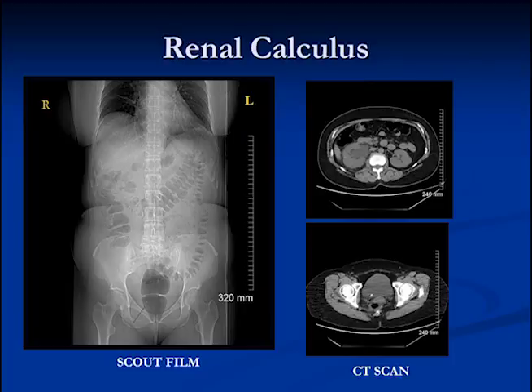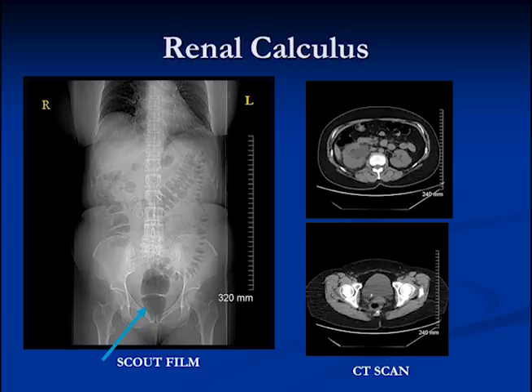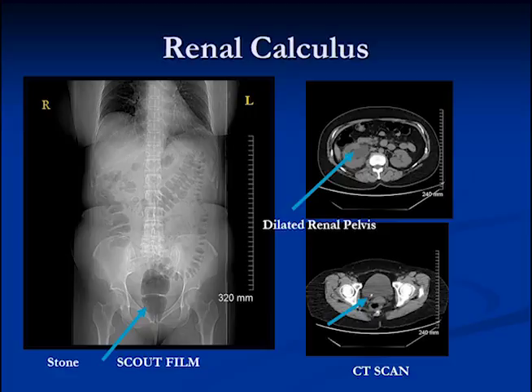Here's a similar case of a girl who came in with pain on the right side radiating to her bladder. You can see this tiny little speck of calcification, which actually represents a renal stone. In patients where we do CT rather than IVP, we don't inject any contrast media — most calculi contain at least some calcium and can be seen easily on a non-enhanced scan. On CT we're looking for dilation of the pelvic calyceal system on the affected side and a little stone down in the distal ureter. We do axial cuts all the way through the abdomen, and almost all patients who present with renal colic now get a CT scan — they don't get an IVP anymore.